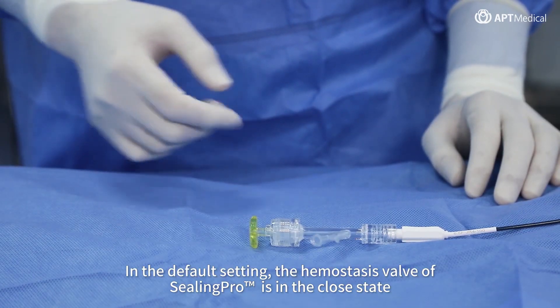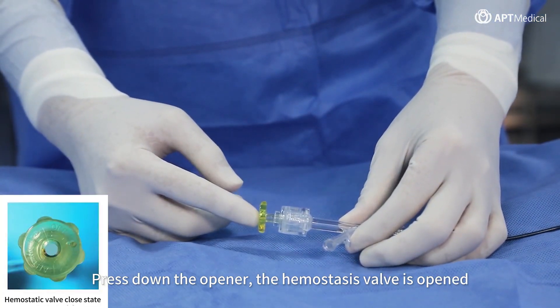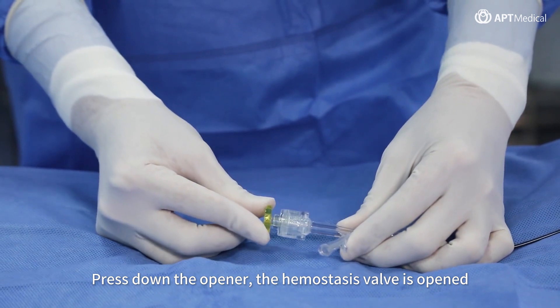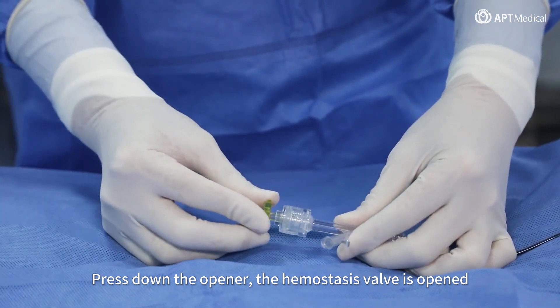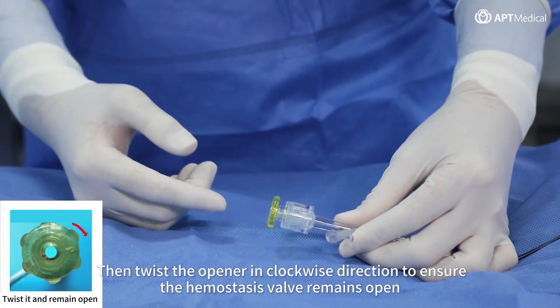In the default setting, the hemostasis valve of CeilingPro is in the closed state. Press down the opener and the hemostasis valve is opened. Then twist the opener in a clockwise direction to ensure the hemostasis valve remains open.